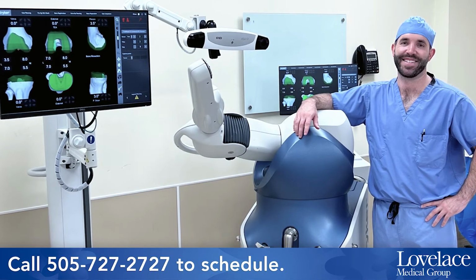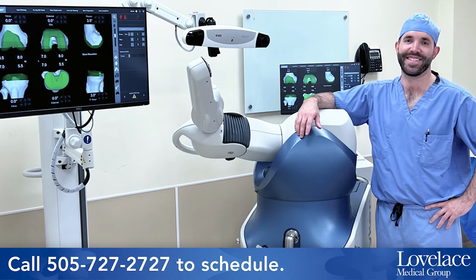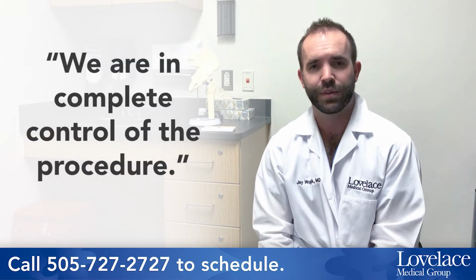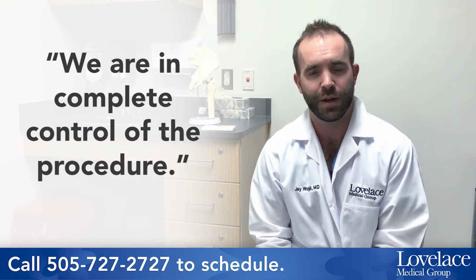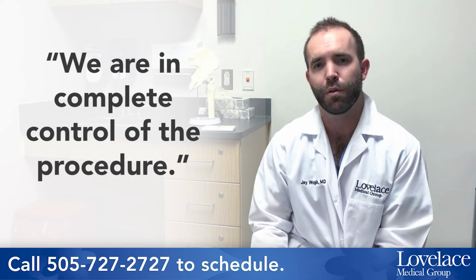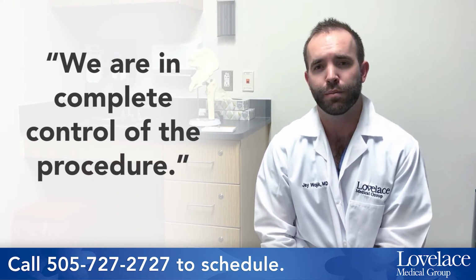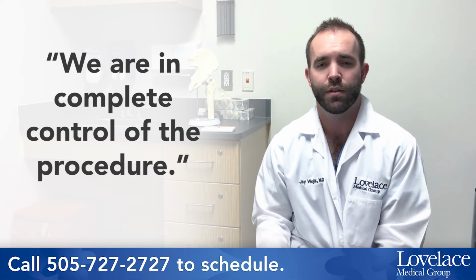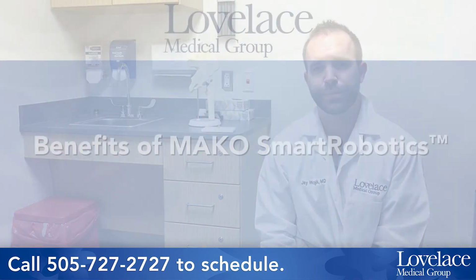I've heard a couple concerns about robotic-assisted surgery, one of which is patients want to know if the robot's performing the surgery. Luckily, surgeons still have a job. We are in complete control of the procedure. We really just use the robot's haptic arm to help us be more precise. In some ways, that can help us protect the patient and their adjacent soft tissues.